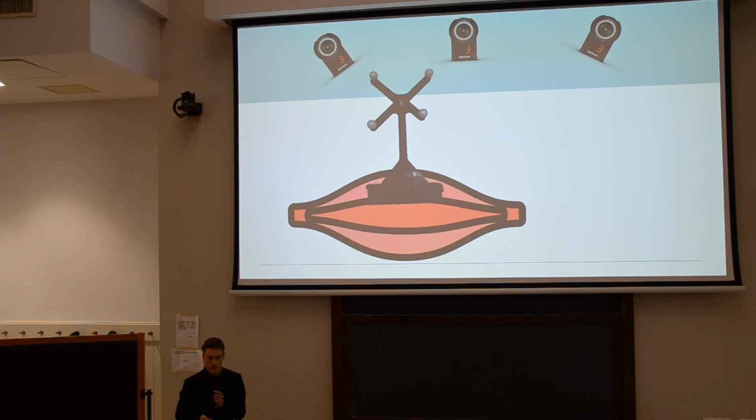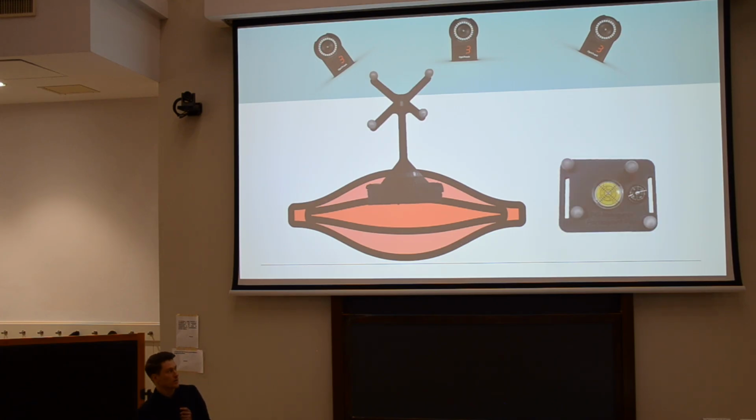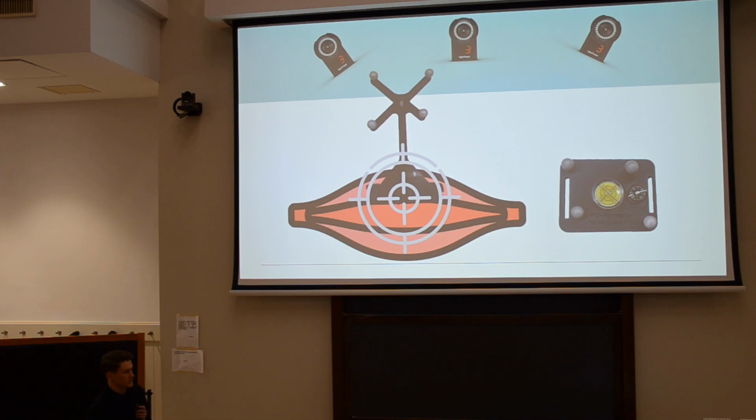What if we would use motion capture instead? So you do the markings on the participant on the muscle the first time. You use a motion capture system and a probe that is displayed here with markers. And what you then do is you apply a reference on the participant. In our case, it's this plate that has a compass to standardize rotation and a bubble level to standardize tilt. And then you would search your preferred image point. And what you would then do is register the position of the probe and of the participant plate and keep and save their coordinates.